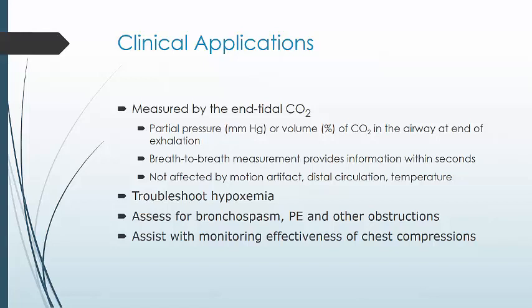For acidosis, blood pH drops below 7.35, and if we have respiratory acidosis, then there is a high end tidal CO2 and a low pH. And this acidosis, we remember, is going to cause a right-sided shift to the oxyhemoglobin dissociation curve, which means the oxygen is going to have a difficult time binding to the hemoglobin. This is going to reduce your oxygenation to the cells. Wouldn't it be awesome if we could see if this was happening? I think so.